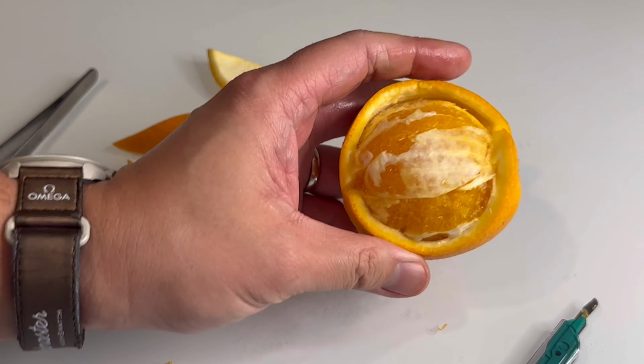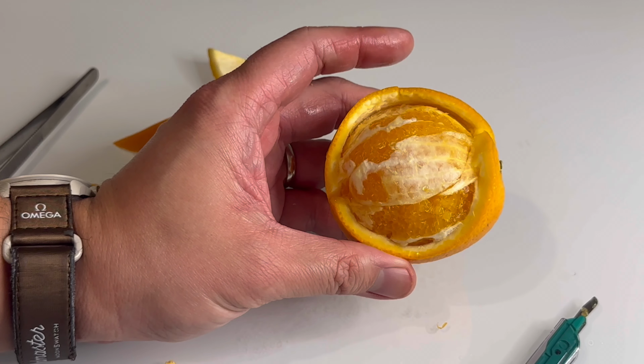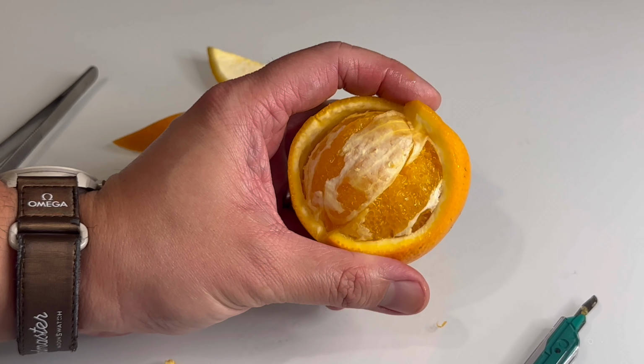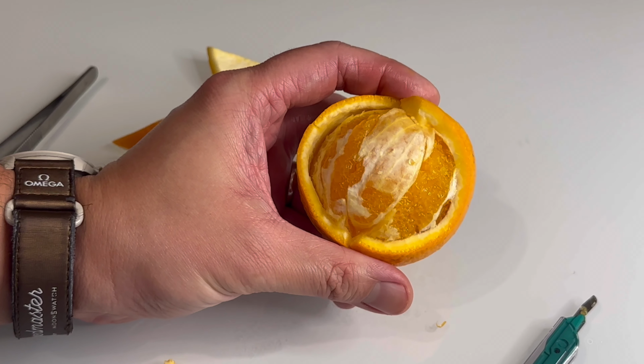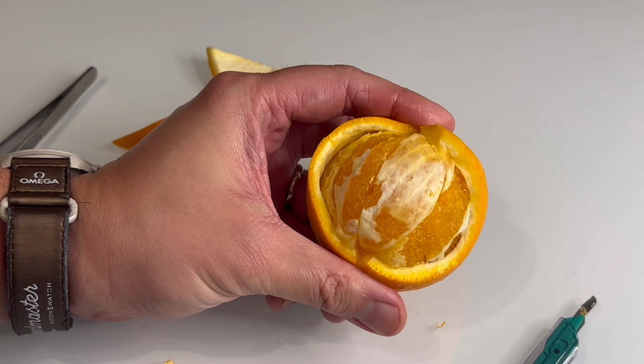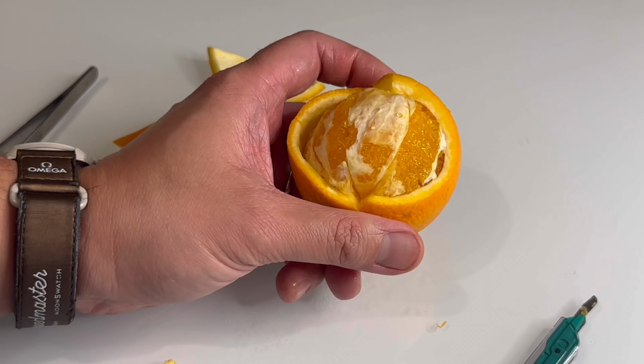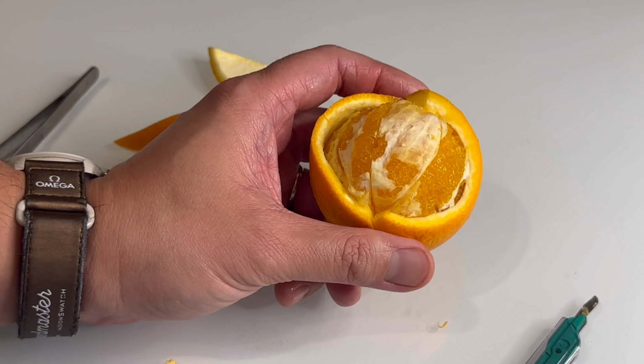So I hope this analogy using an orange to show you tissue planes helps you practice your dissection skills to understand planes better. Understanding that it is a combination of retraction and exposure while following with either blunt or sharp dissection to follow tissue planes.